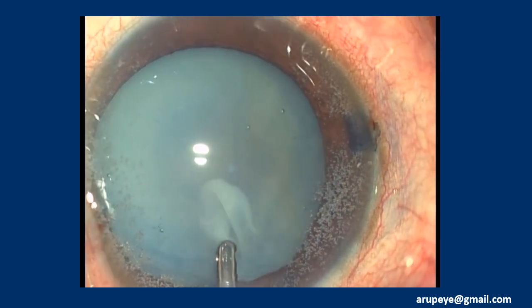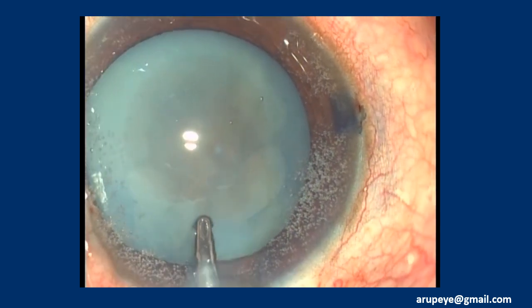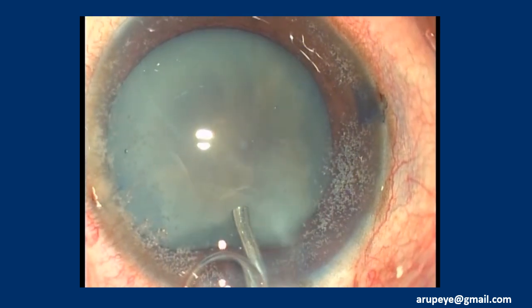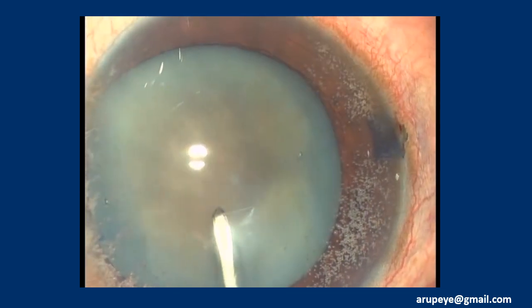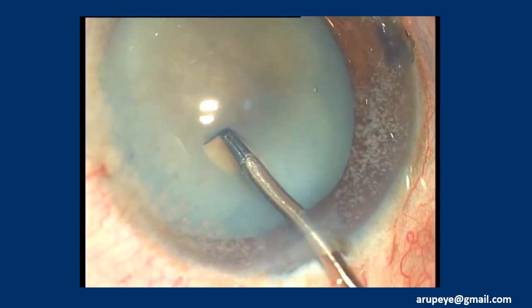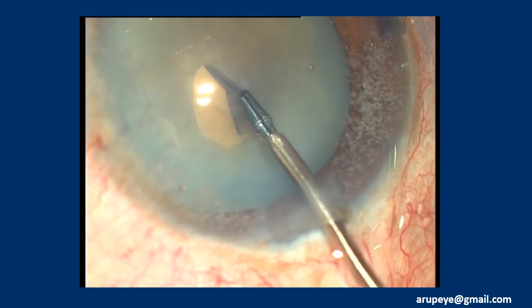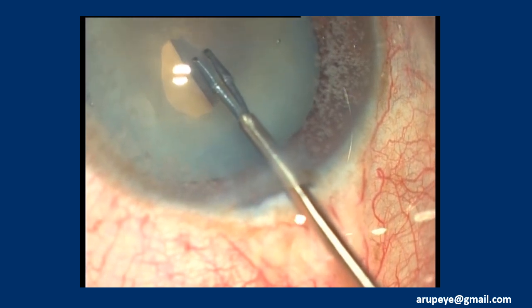Alternatively, a cystitome can also be used. Explosive release of liquefied lens matter is prevented by the high-pressure environment in the anterior chamber. The slowly escaping white liquefied lens matter obscuring further view is carefully aspirated under low parameters, taking care not to shallow the anterior chamber. Rapid irrigation currents within the capsular bag at this stage may risk peripheral extension of the linear capsulotomy. Though the capsular extension in this case was minimal, visco-expression of the leaked-out lens matter would perhaps be a safer alternative.